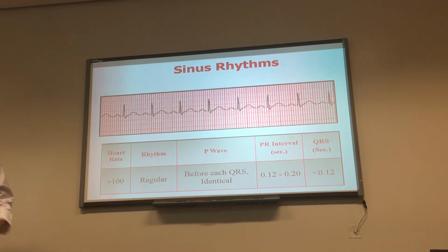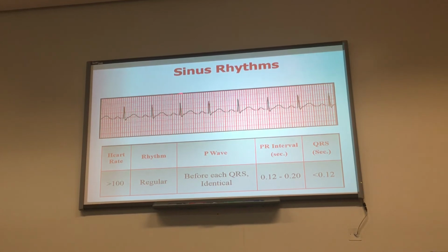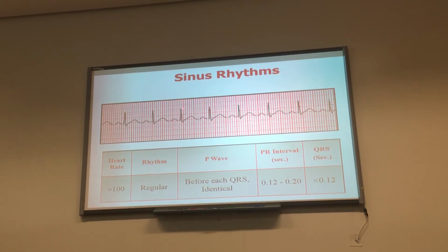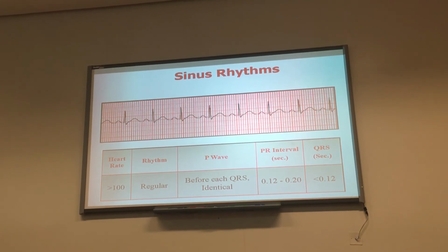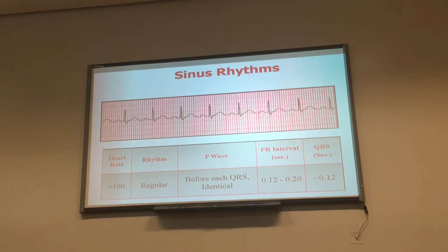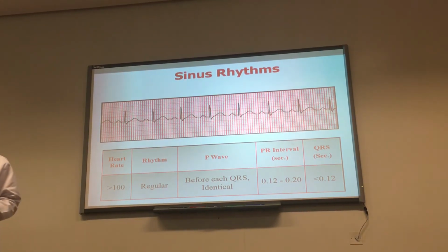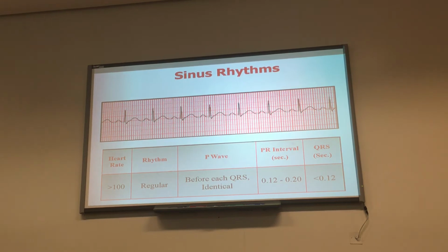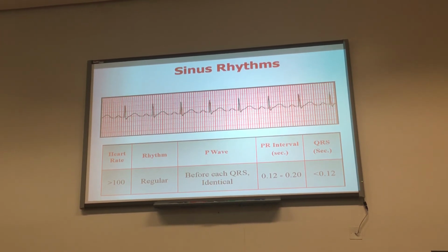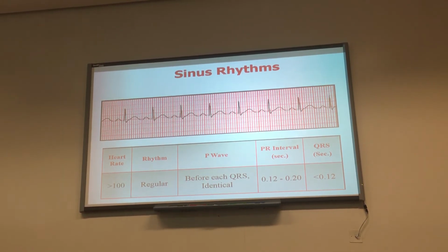This one. Tachycardia. Okay, why sinus tachycardia? It's greater than 100. You measure 1, 2, it is actually 2.4. So 300 by 2.4 is 120. So if it's 120 beats per minute, regular or irregular? Regular. Any P wave abnormalities? No. QRS complex abnormalities? PR, QT normal? So we are dealing with sinus tachycardia.